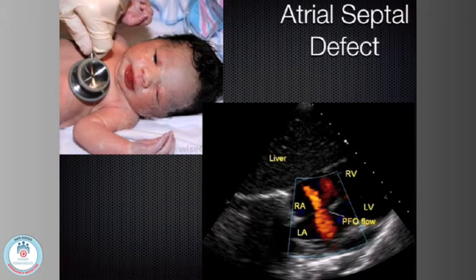Okay, cool. Here's another little fun factoid you can do with ultrasound of the heart. Subxiphoid view. This is the view all the surgeons first learn when they do the FAST exam, right? Put it below the liver. The patient takes a deep breath. With the liver, you can see the heart really well in the subxiphoid or subcostal view.